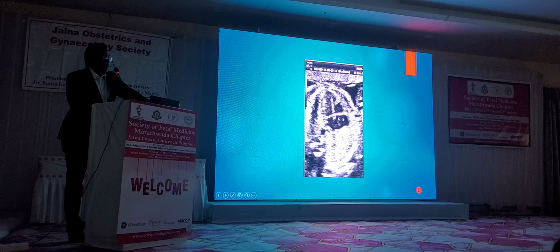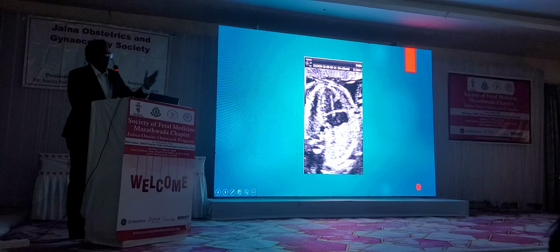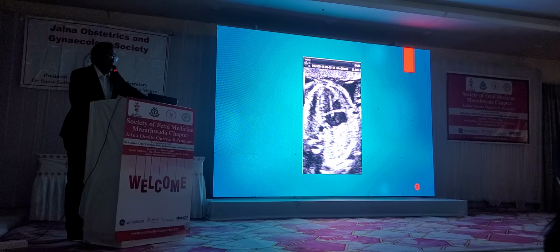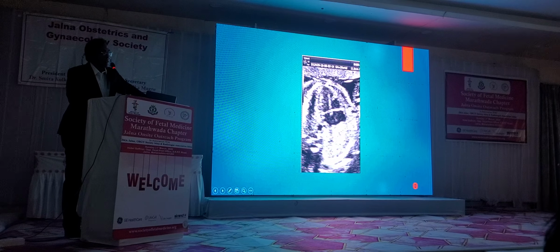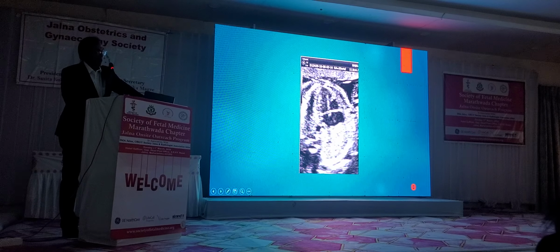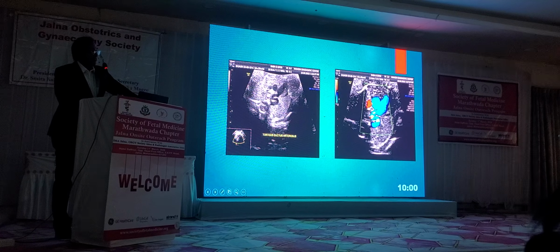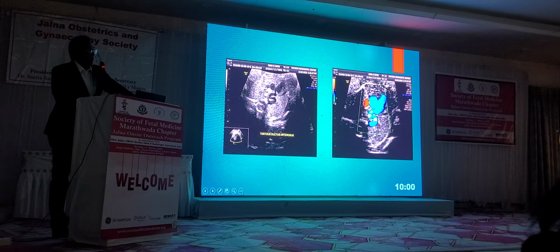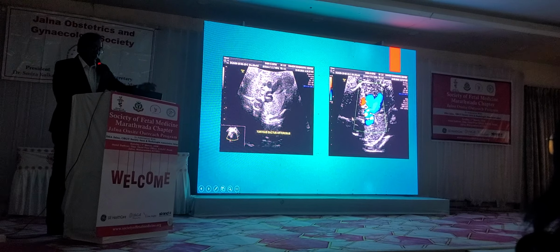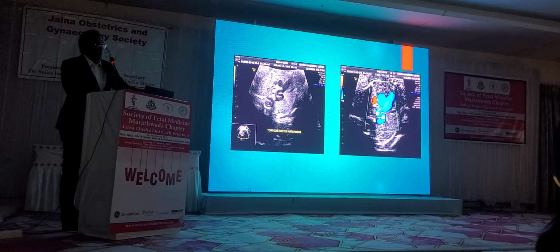A few uncommon normal variants. I told you that both the atrioventricular valves should show an offset normally, but here that offset is absent. Rarely you will see this. These fetuses have some association with Down syndrome, but if seen in isolation, they are normal. You see this three vessel view, and this is an S-shaped ductus arteriosus, that is, a tortuous ductus arteriosus. It is a normal variant again, except for maybe a slightly high chance of thrombosis.